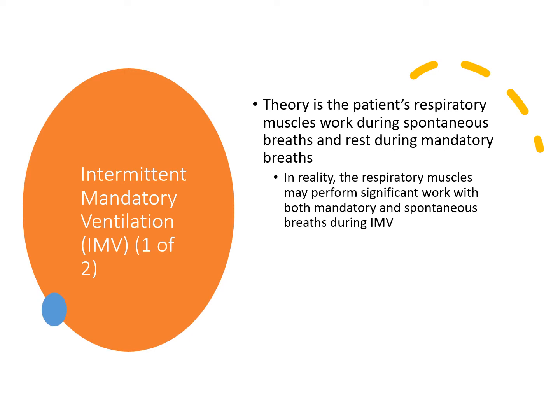Usually those patients back in the 60s and 70s, what they did is they added continuous flow, and then it allowed them to breathe spontaneous through a second bag or SIMV bag. It was kind of an interesting setup, and there's a picture of it in your book. They had a blended gas source in this little reservoir 3-liter bag, and we're talking adults here, for a big adult circuit. And really, it was a one-way valve, so that allowed the patient to breathe through if they were trying to breathe on the ventilator and it wasn't delivering one of the mandatory breaths. It allowed them to breathe through that one-way valve into that bag.